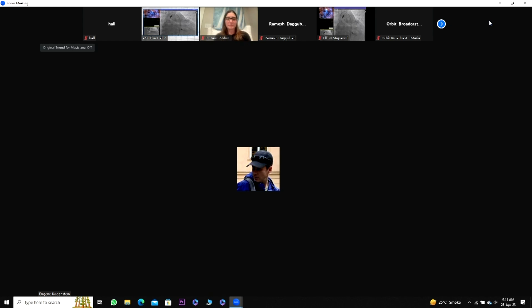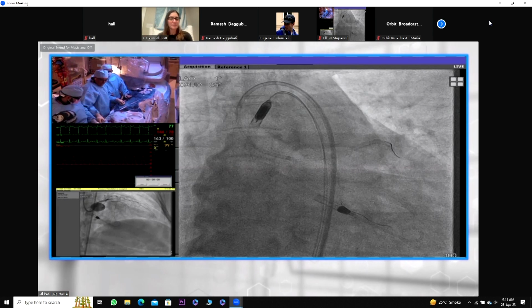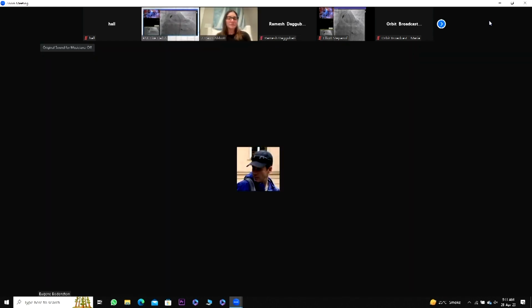So for recrossing, does it really matter where you cross? Bashir, we were just talking about that. We try and go into the proximal strut, but as I stated, my own goal is just to make sure I can get something across.